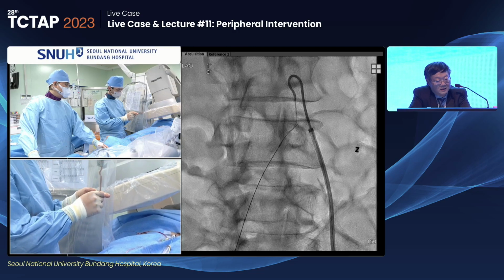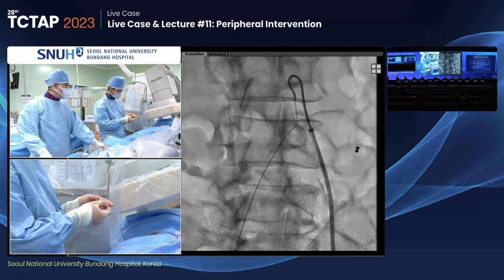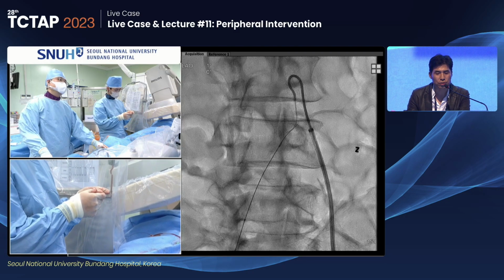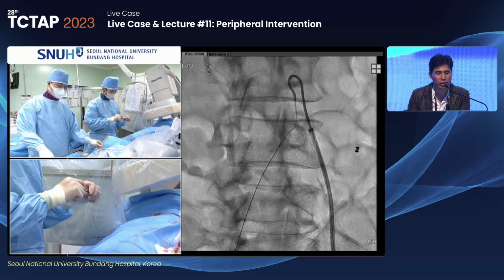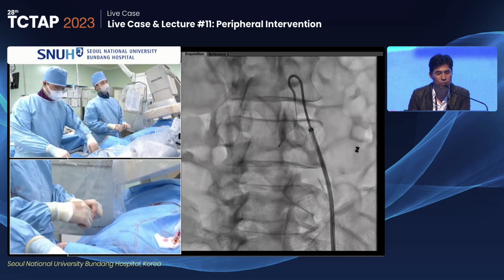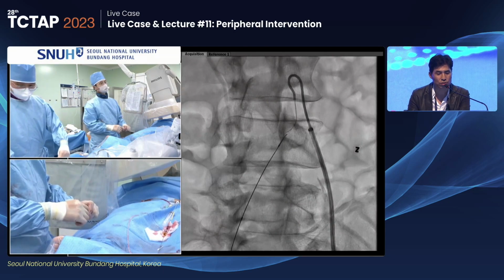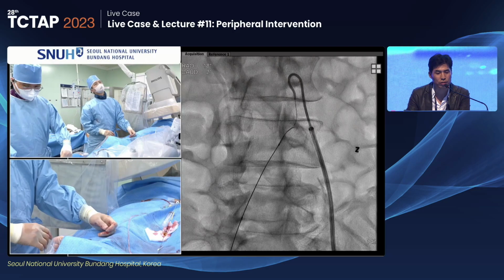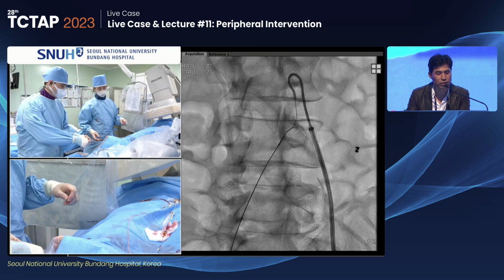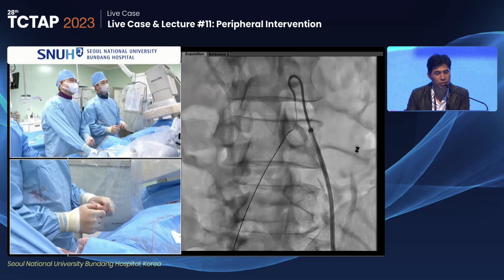Yeah, it is also a good option. I think this retrograde wire is located in the subintimal space, maybe from the middle part of the CTO. So at this moment, you can use the antegrade approach again with a directional control guide wire such as Halberd or Astato with a wire marker technique. If it's unsuccessful, you may consider a little more advanced technique, directional control of retrograde wires, so they meet together inside the CTO. If it's unsuccessful, you may apply IVUS evaluation of the wire location.